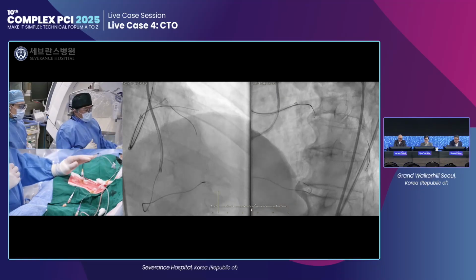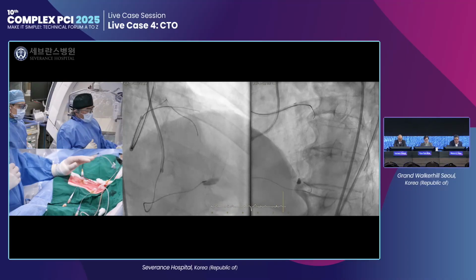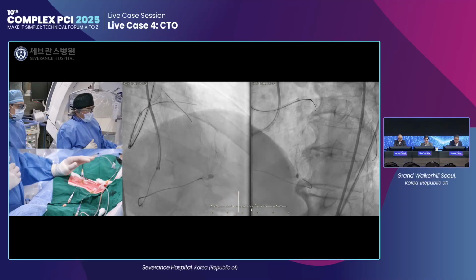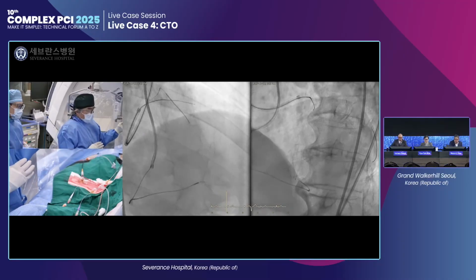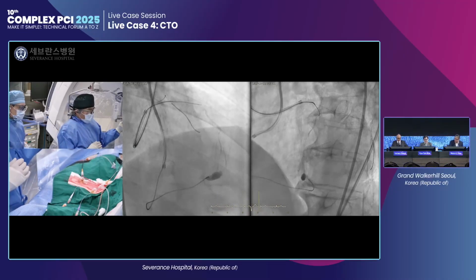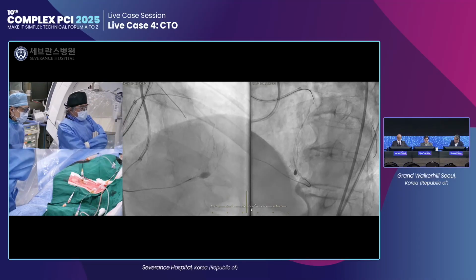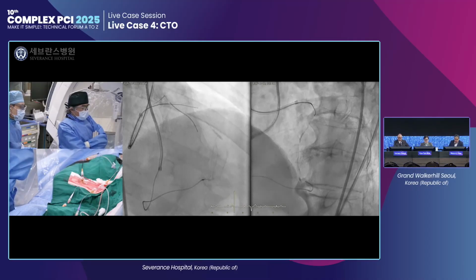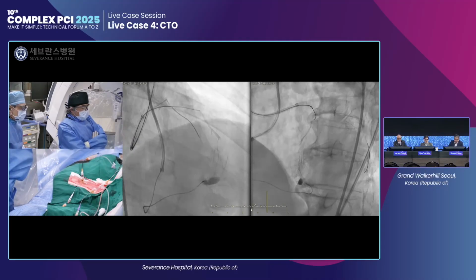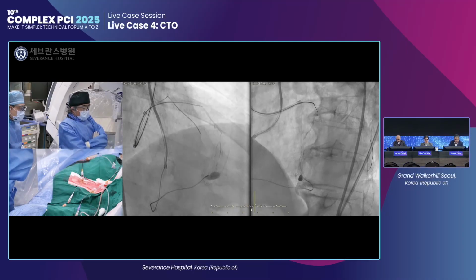Okay. So you didn't change the position of the retro catheter? No, I think the position is the same. I just changed the angle. Okay. But personally, I would not use this septal channel anymore. Even though, like Otsuji sensei said, from the lateral projection the hematoma seems to be outside or anterior to the channel, I think it's still too dangerous.